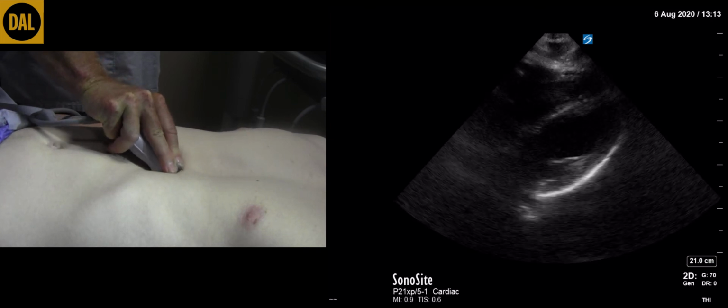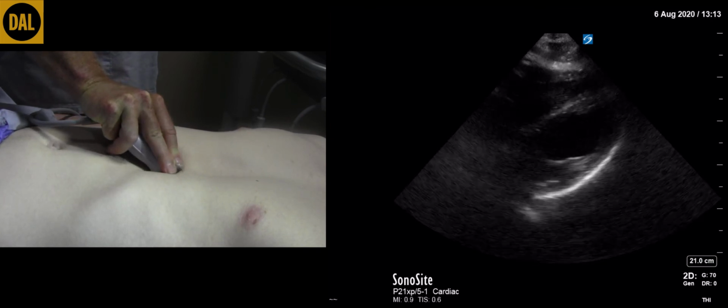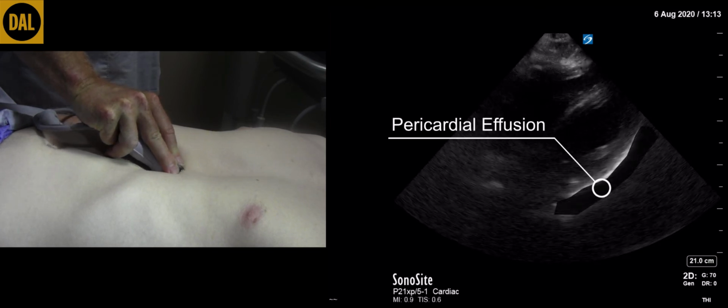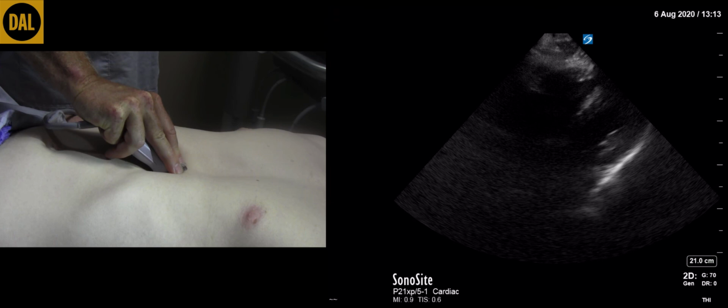Finally, assess the pericardial space for the presence of an anechoic collection, which would indicate a pericardial effusion. This completes the subxiphoid view of the heart.